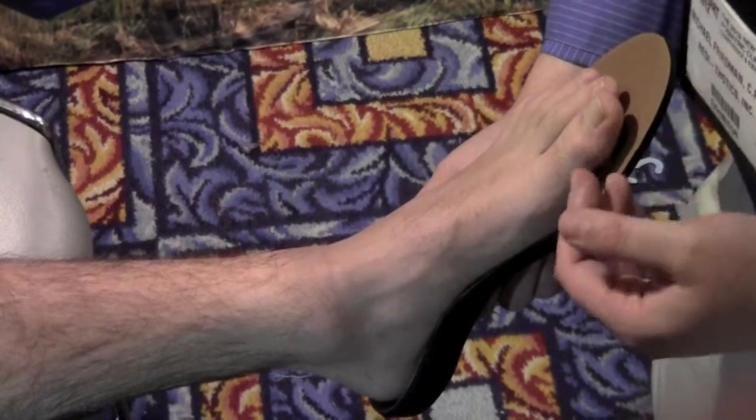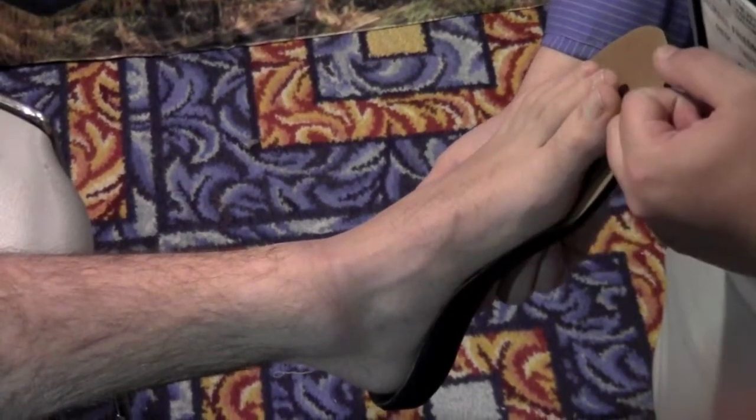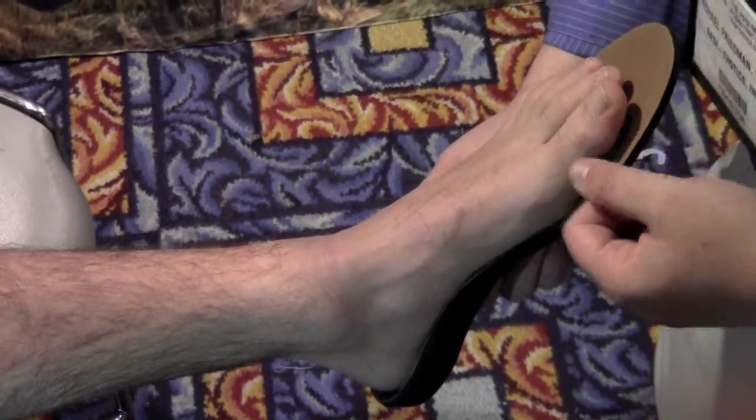It's a very natural arch, as you can see. In addition to being available in a full-length version, it's also available in sulcus length, so that in shoes with very little toe box room you can still have all these support and comfort benefits in a tighter fitting shoe.